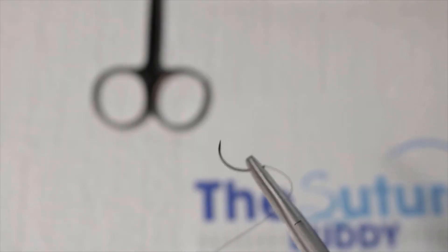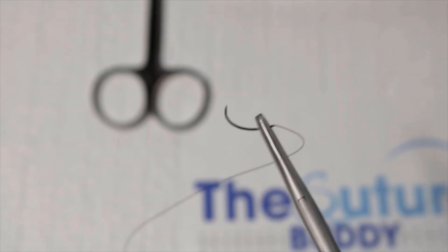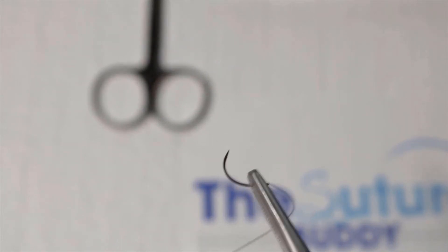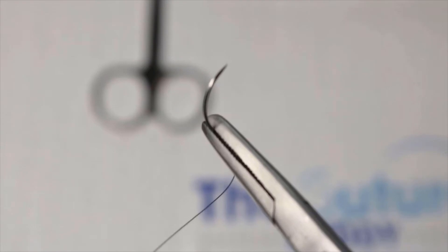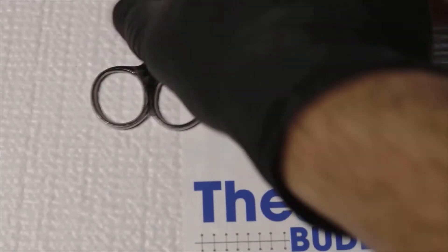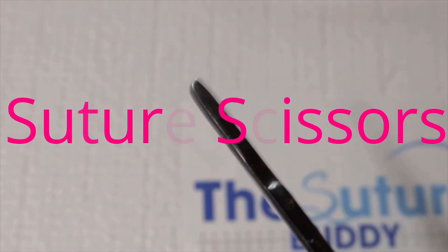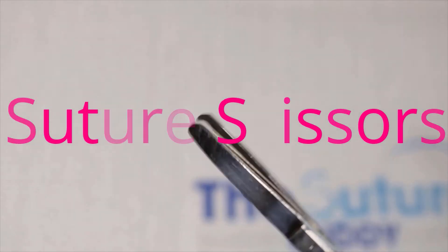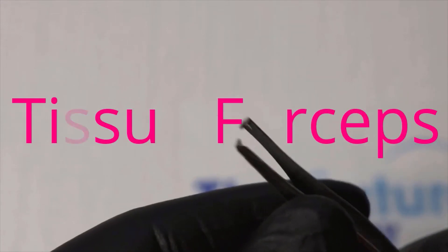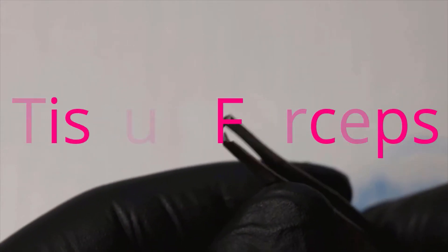Let's go ahead and load our needle. All right, more self-explanatory are our suture scissors - we cut the sutures when we're done. And lastly, our tissue forceps. Here we have some Adson tooth forceps, but you can use the ones without the teeth as well.